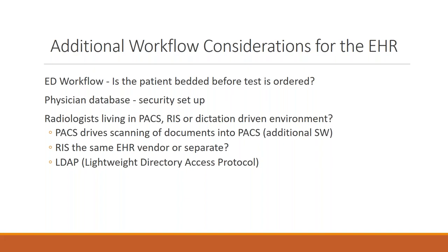Are your RIS and EHR vendors the same, or are they separate? Are you looking at a seamless integration, or are you actually going to have people working and mapping these fields over that we talked about earlier and make sure that they're there? And then now we're talking about your LDAP again. If you have two systems, you've got to launch one that's going to launch the other.